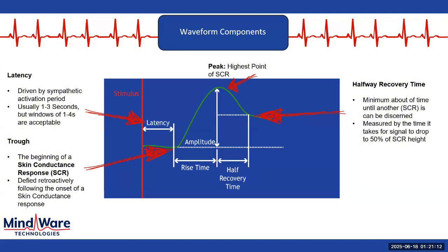And so what we can see in these spontaneous little moments are rises in skin conductance that, in most cases, come back down to a baseline point. These are known as SCRs. In looking at these, we can also implement a stimulus presentation.